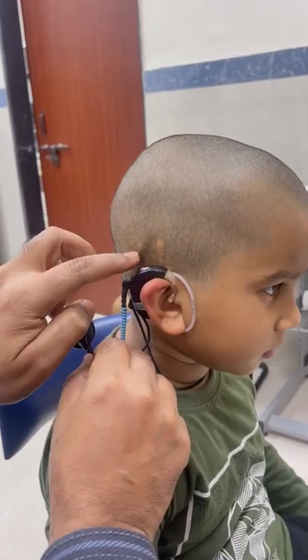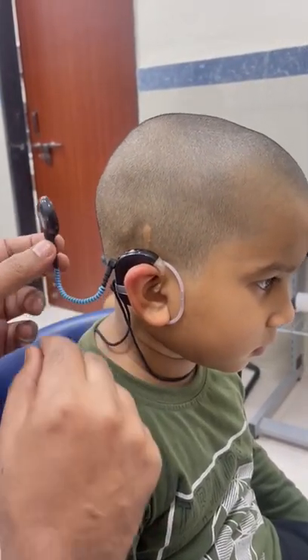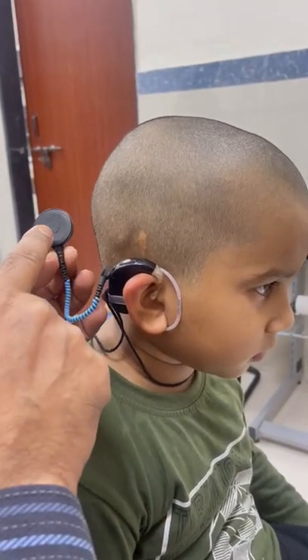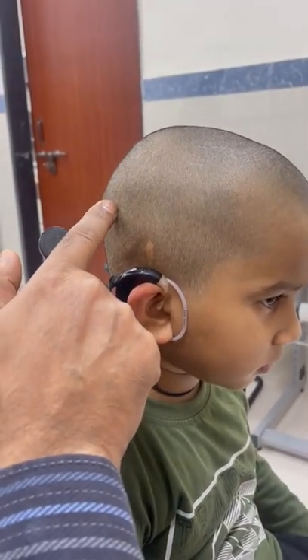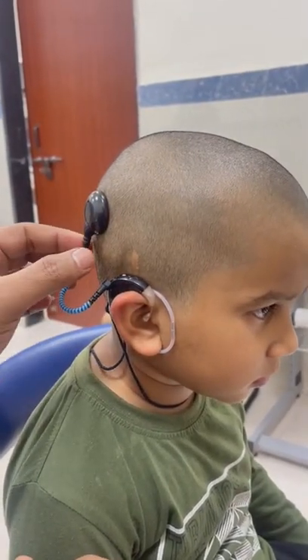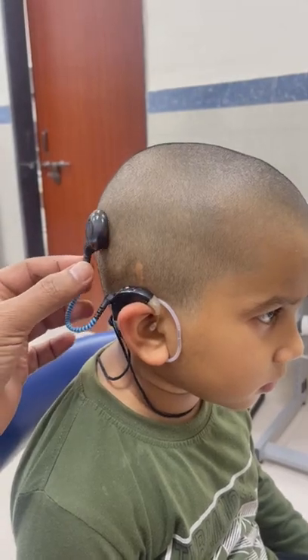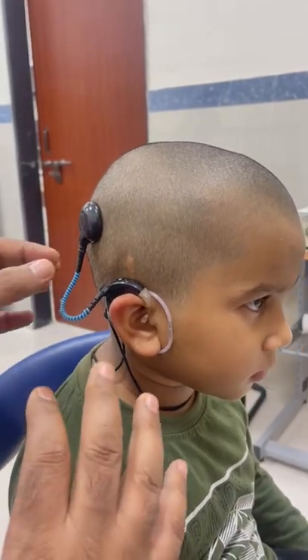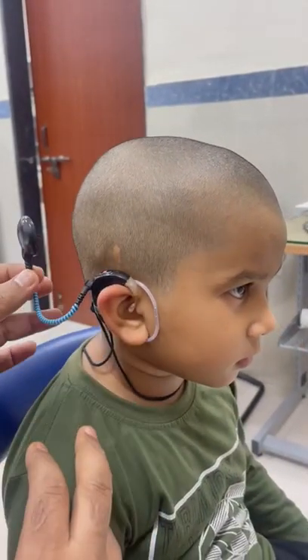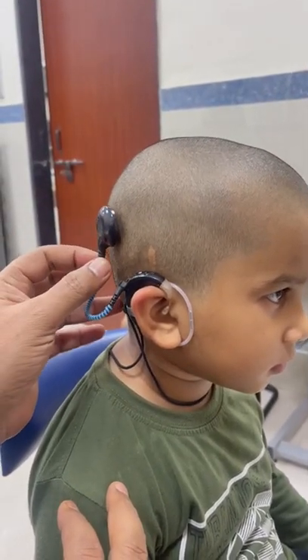The bulge you can see here is the internal component of the implant. Both the external transmitter and the internal component have magnets. Because of these magnets, the external part sticks onto the scalp, with the skin and scalp coming in between the two components.